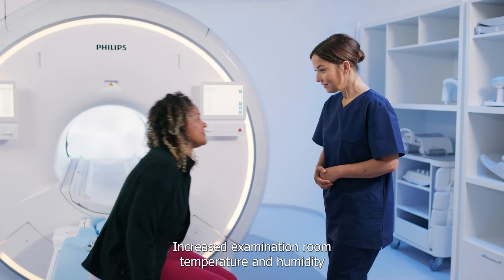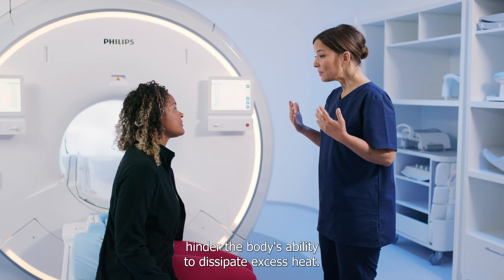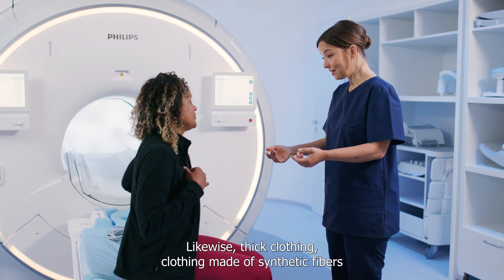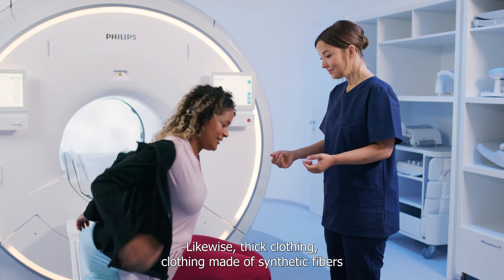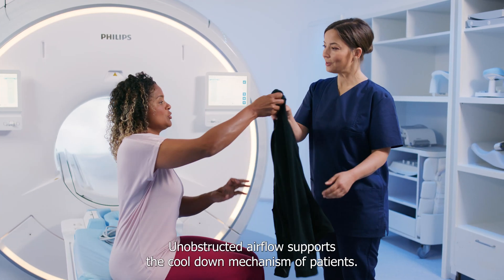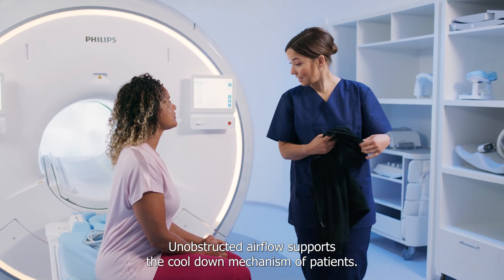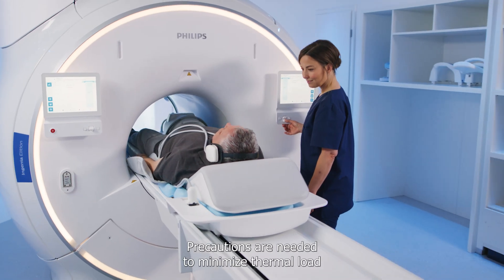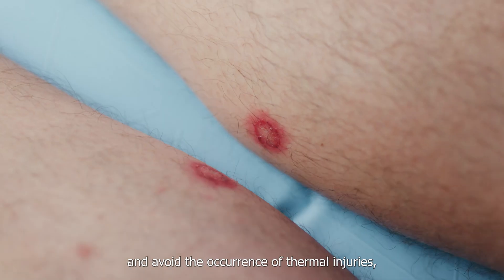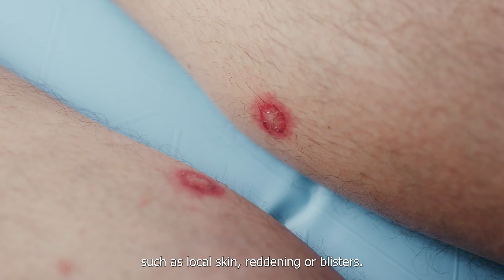Increased examination room temperature and humidity hinder the body's ability to dissipate excess heat. Likewise, thick clothing, clothing made of synthetic fibers, and blankets hinder heat dissipation. Unobstructed airflow supports the cool-down mechanism of patients. Precautions are needed to minimize thermal load and avoid the occurrence of thermal injuries, such as local skin reddening or blisters.